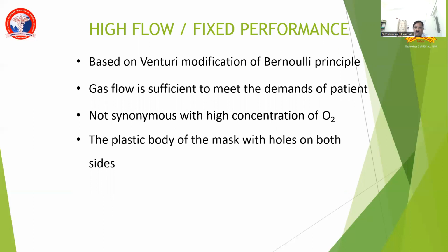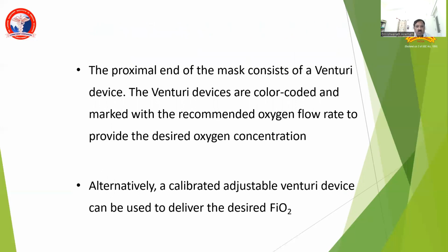Flow rate is adjusted depending upon the demands of the patient, not synonymous with a high concentration of oxygen. The plastic body of the mask has holes on both sides. The proximal end of the mask consists of a Venturi device, color coded and marked with recommended oxygen flow rates.